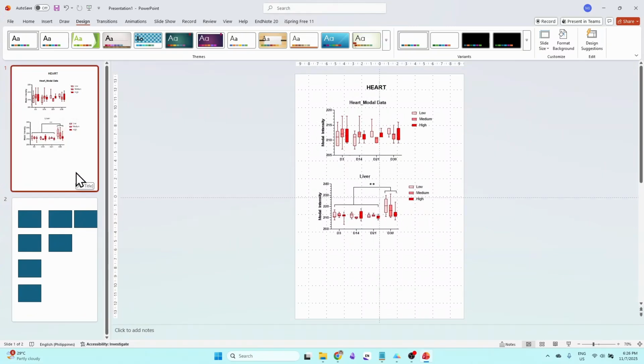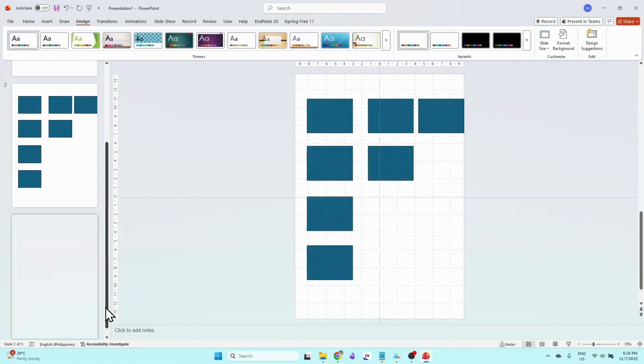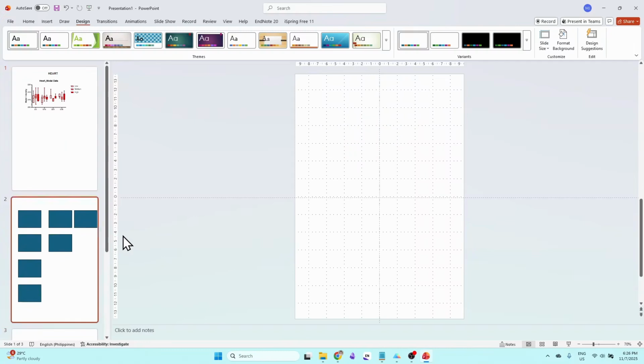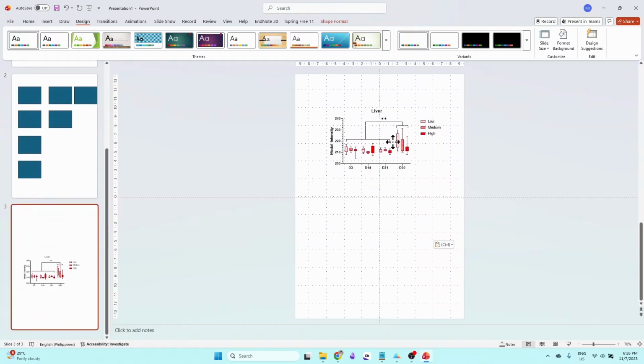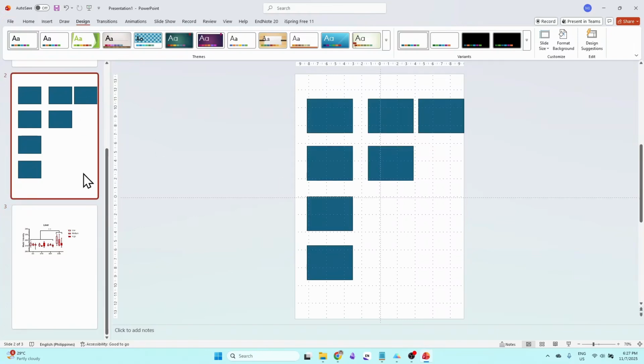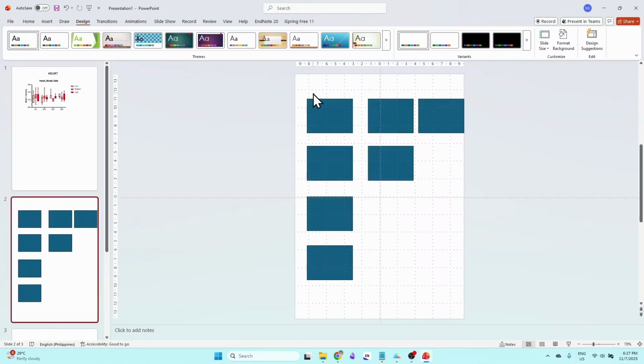Actually, it's best to create a new slide per organ, 2 slides at least per organ. So I will cut and paste it here. And then here you can put the mean intensity data, the subgross data, etc. And then again, this one is, for example, the actual, you can create another figure. So one slide is one figure, okay? So you can create another figure with the actual photo micrographs that you took, okay?